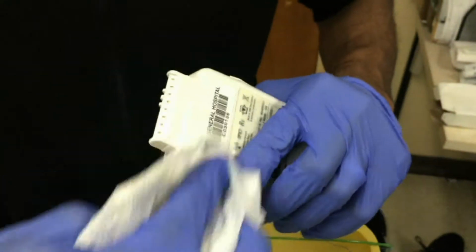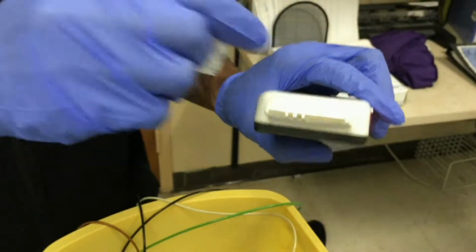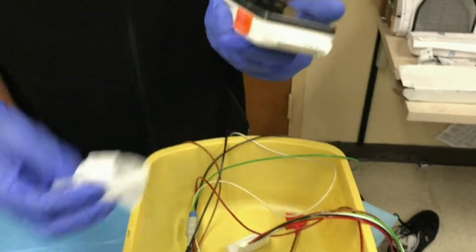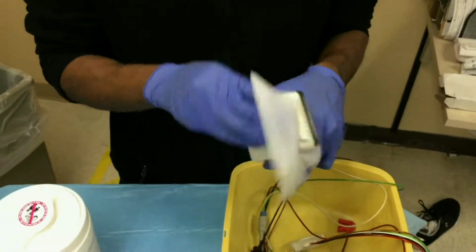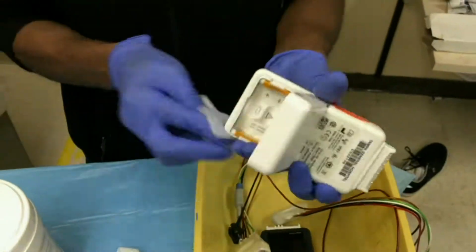Avoid cleaning the metal prongs unless you notice they are visibly soiled. This is again because the Cavicide wipes will corrode the prongs, which in turn will cause interference with the connection. Finally, you want to make sure you go over the monitor one last time to ensure that all debris is removed and the monitor is properly disinfected.